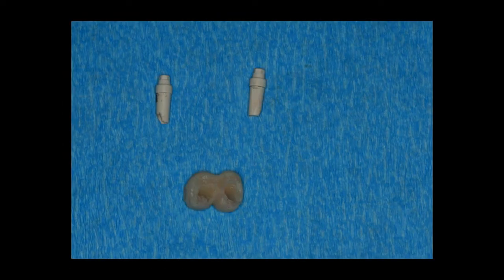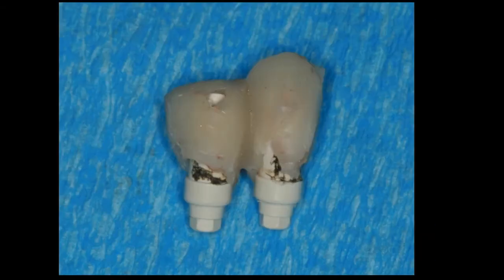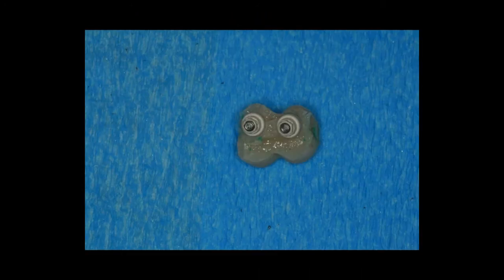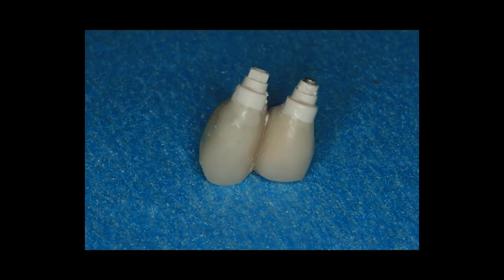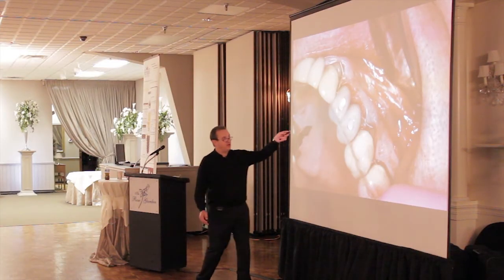We take a preliminary impression made ahead of time, fill it up with Exactotemp or Integrity, then take it all out of the mouth. We unscrew the PEEK abutments, go in the lab, and insert these into the integrity. It looks rough initially — we clean it off, fill in with flowable composite, put it on the lathe, polish it up, and reshape it. We wind up with a nicely polished provisional with a good emergence profile, which we screw right into place in the mouth.